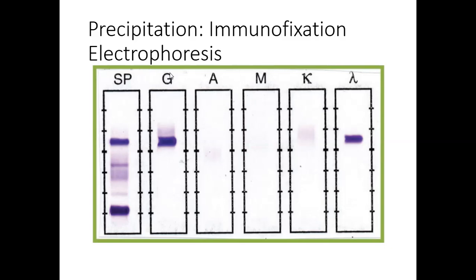So in this technique that we see here, what we see is this again is all the serum proteins. So we see all the different proteins that are contained in serum, in a reference serum. But this patient has an IgG with a lambda chain, so that the immunoglobulin that we're looking at in the patient's serum to see what's in concentration happens to be an IgG with lambda chains. You can see a little something happening here, but it's not significant, and it's not what we're looking at.